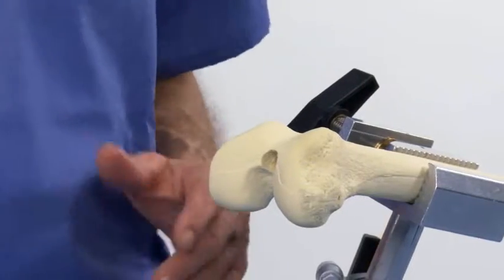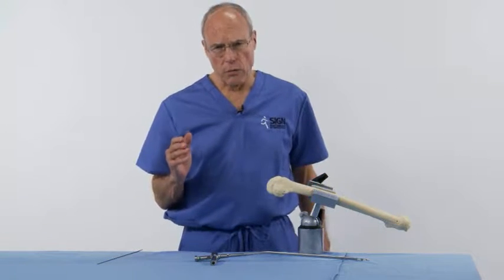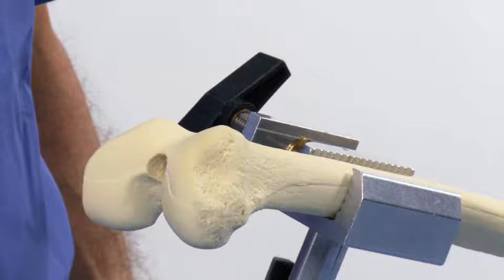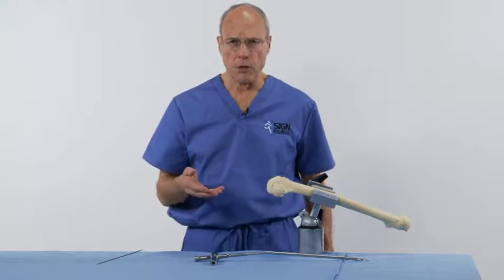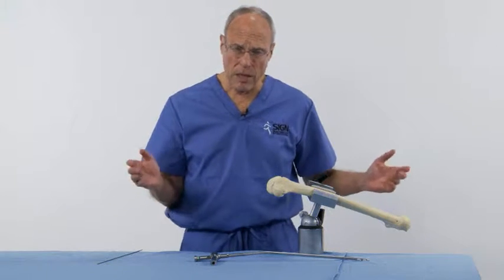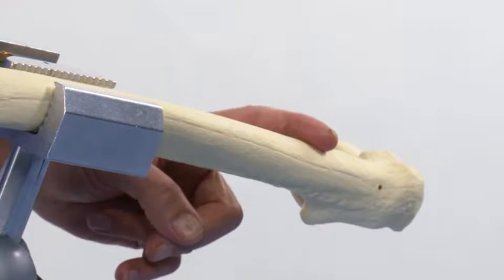The retrograde approach to the femur is chosen when the fracture is near the distal end of the femur. There may be anesthetic reasons for using a retrograde approach because the patient is supine. If the patient has a lung injury or a head injury, many times the anesthesiologist will prefer the supine position. In that case, fractures as high as in the proximal third can be done, and I've seen many segmental fractures treated with retrograde approach where the second fracture is next to the lesser trochanter.